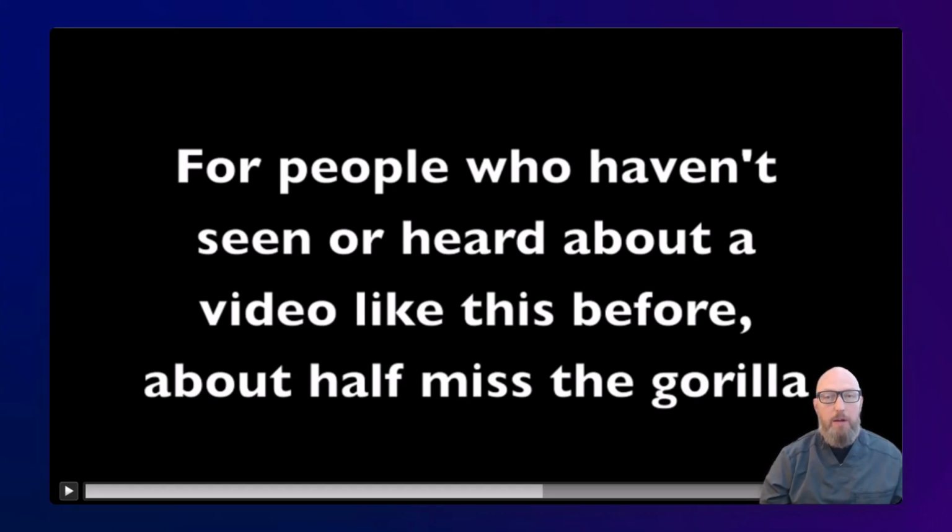And when we're talking about cone beam CT, that's a whole lot of additional information. Now you're talking about the whole skull base, and instead of just a single image, you've got an entire volume that you've got to scroll through. So think of a CBCT like you're watching a movie. But even if you're just looking at 2D and pano, whatever radiograph you're looking at, you've got to be scanning for that unseen gorilla. Look for something that you might not first spot.